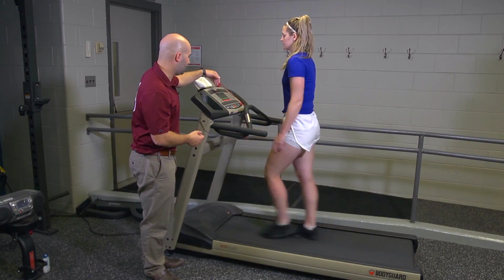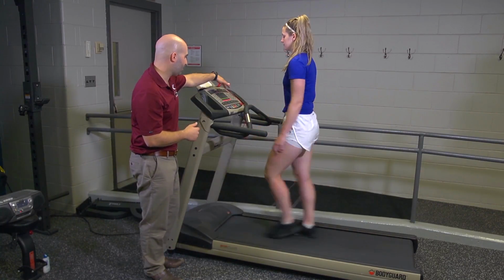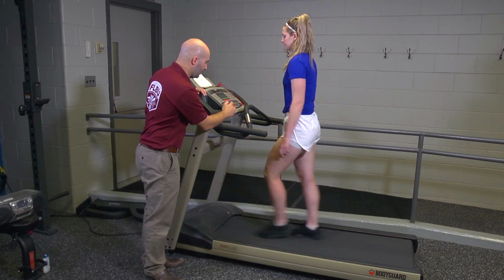So right now we see Clara's heart rate, because she's still in her warm-up stage, is only about 100. She probably won't climb to 120. Right? Even if I put it at 4 miles an hour, this test, she may just be too fit for this appropriate protocol. But let's assume we're at the working load.